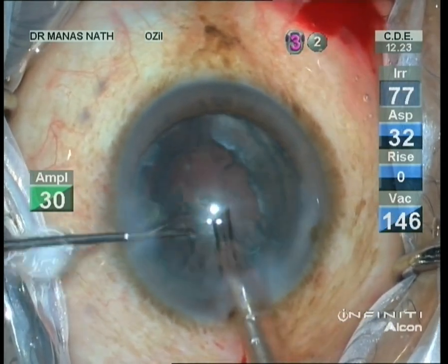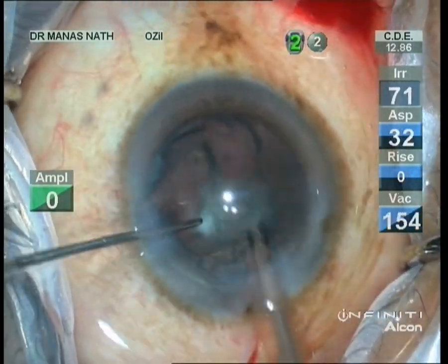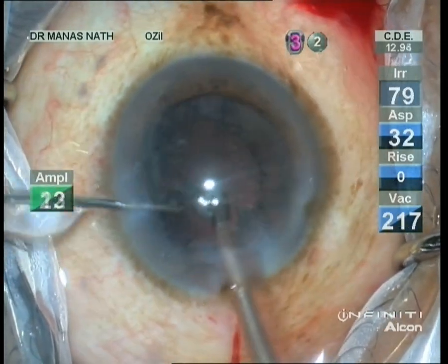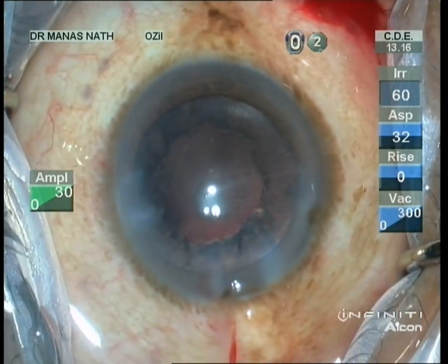Once both heminuclei are gone, it's time to take out the epinucleus sheets which were protecting the posterior polar cataract during emulsification. Never allow the chamber to collapse — put viscoelastic before taking it out.